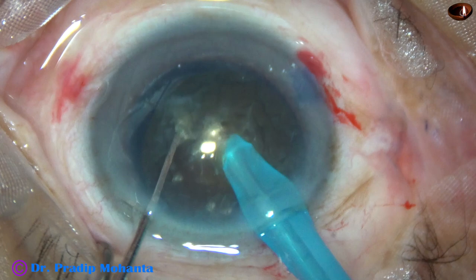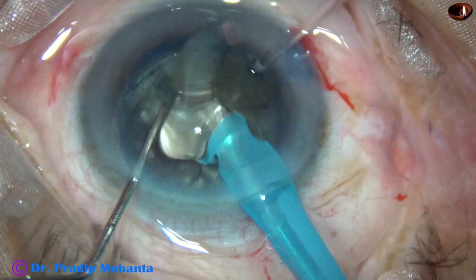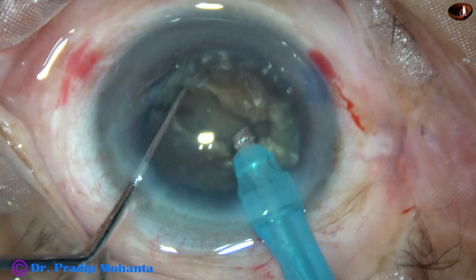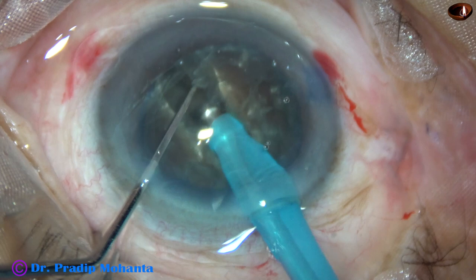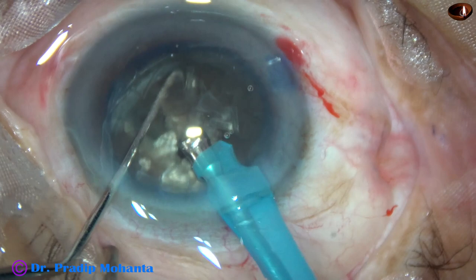And now the nucleus is chopped. This is a nice crack. To divide the nucleus completely into two hemi-nuclei, we have to rotate 180 degrees, come to the other side of the crack, and after two or three sculpts, go to a deeper plane and separate it like this. The two hemi-nuclei are completely separated from each other.